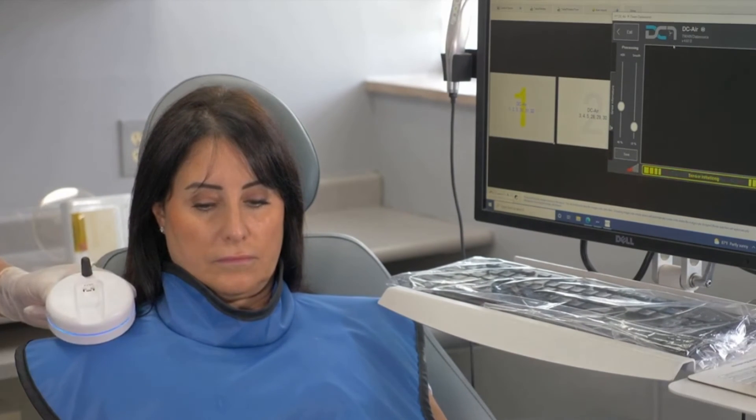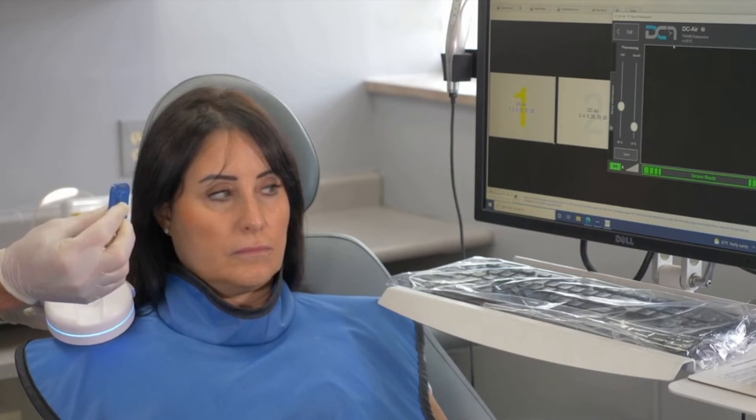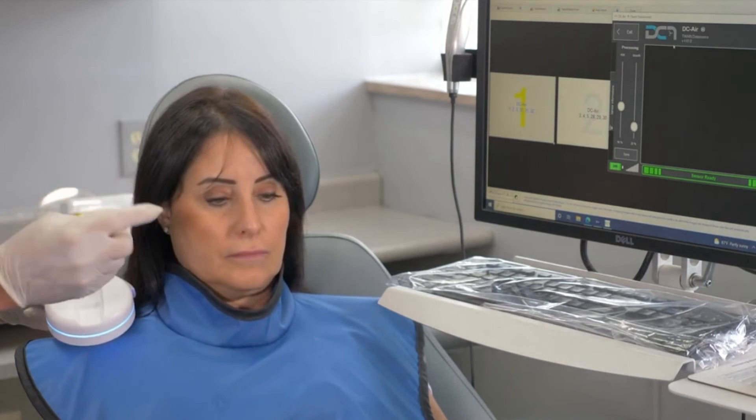Not all big name sensor manufacturers will integrate into other imaging softwares, which means you're locked into either that imaging software brand or the sensor brand. They don't integrate into different imaging softwares, whereas TWAIN allows you to use all different sensor brands with different sensor imaging software. The DCR wireless sensor does work using TWAIN and will integrate with most of the big name manufacturer imaging softwares that are available on the market.